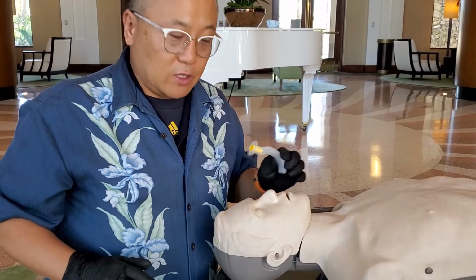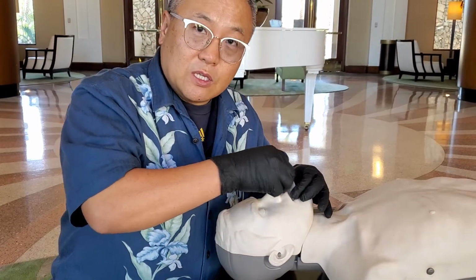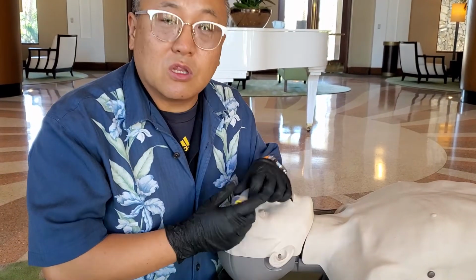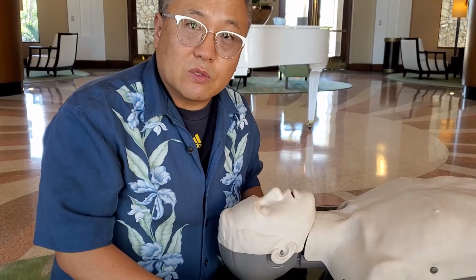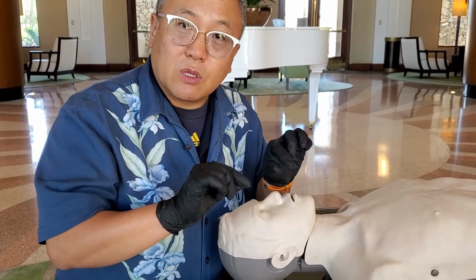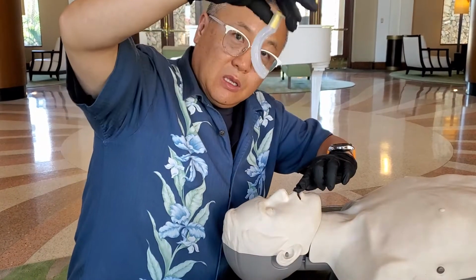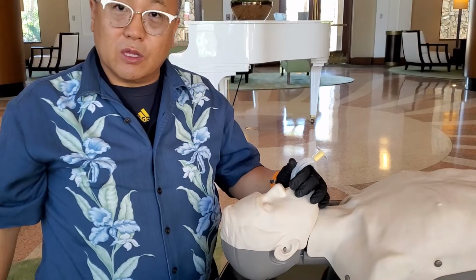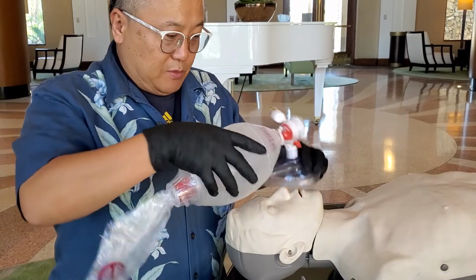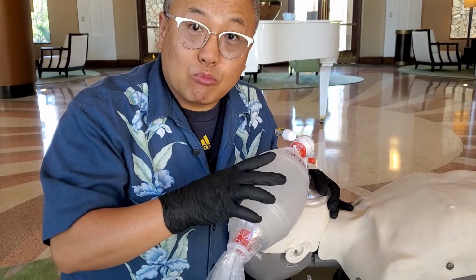And then 180 degrees like this, like that, and then push in the mouth as you go inside, and then turn and push down. Okay, there's a third way to do it. You can use the tongue depressor. When you go to the doctor's office with a pain in your neck, they use a tongue depressor, like a little bamboo stick, put in the mouth and push down. Just put it in the mouth, and then put in the OPA, and then you can give them PPV. PPV stands for positive pressure ventilation.